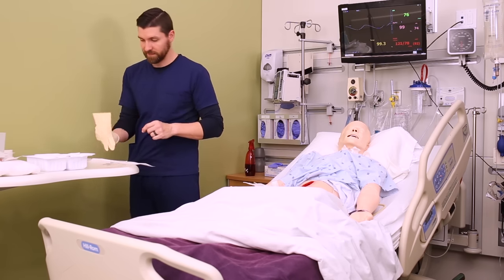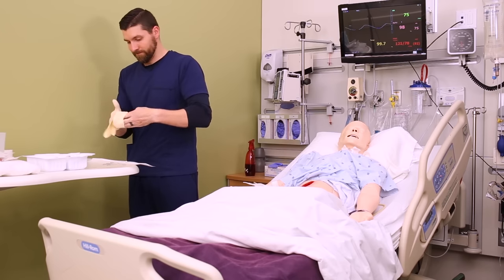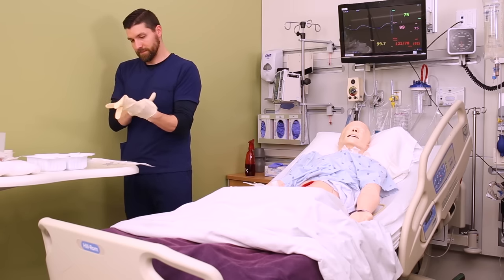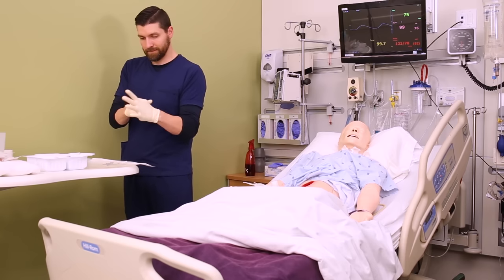Depending on the size of the wound, you might even need two, three, or four packs of sterile gauze — just be aware. I always like to pass this on in report: 'I needed three packs of sterile gauze for this.' So once you get your sterile gloves on, you can start prepping the gauze and your dressing supplies.